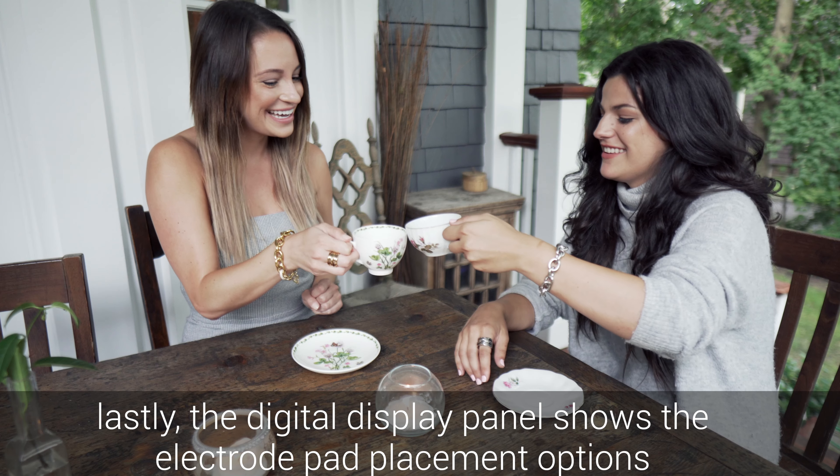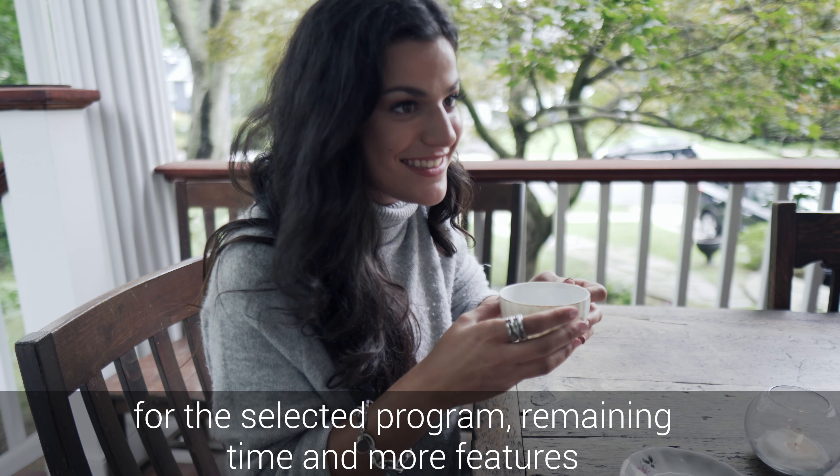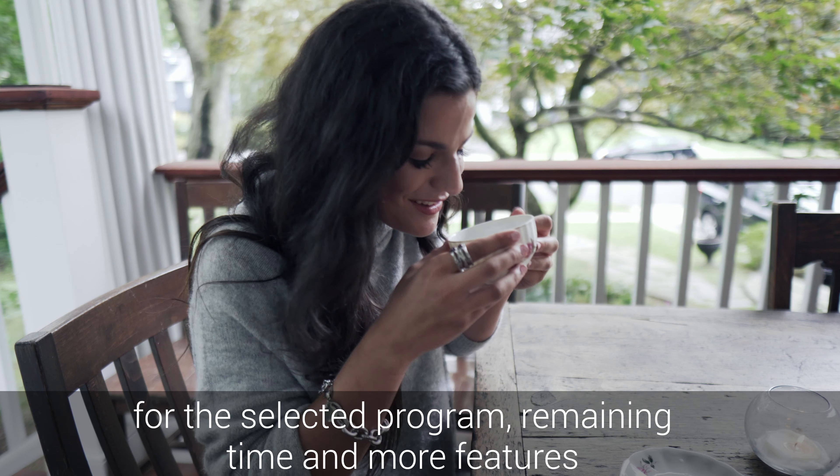The digital display panel shows the electrode pad placement options for the selected program, remaining time, and more features.